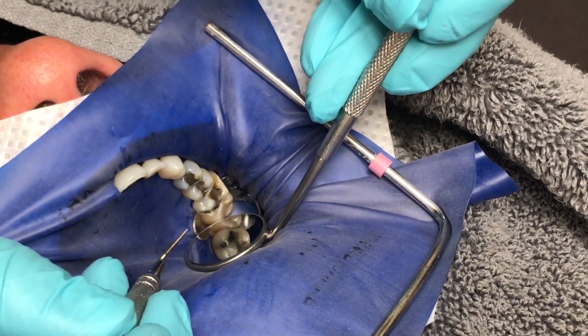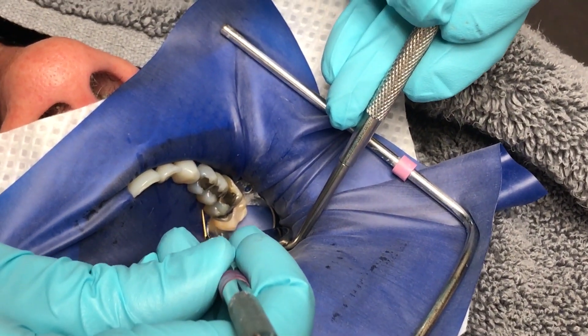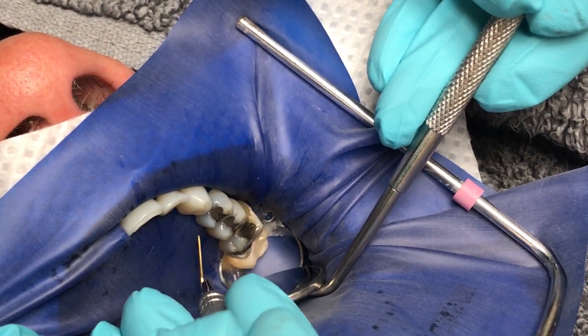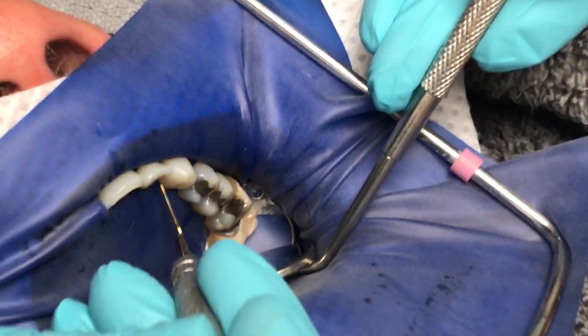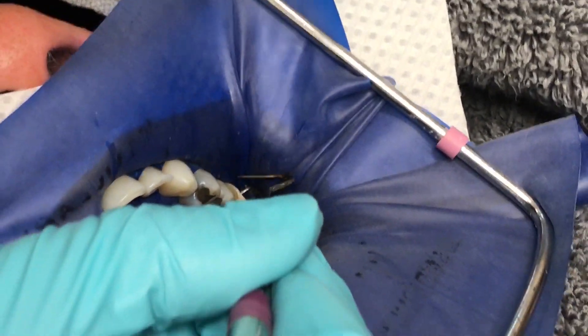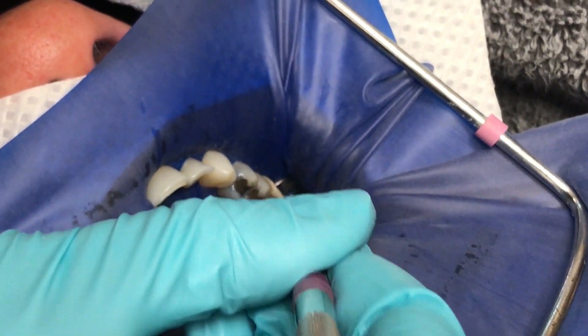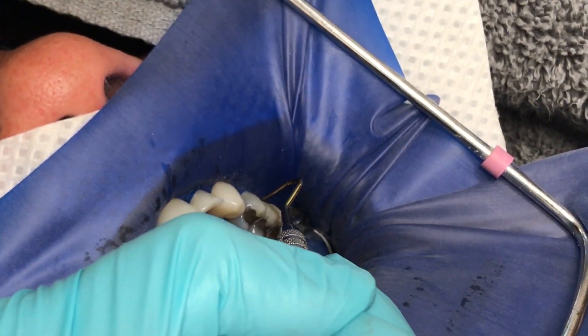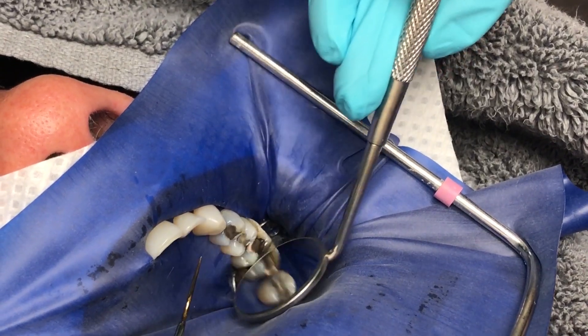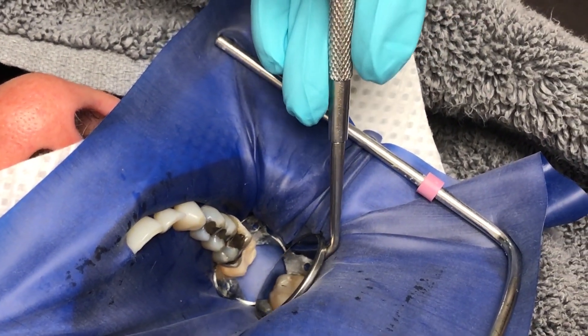Lastly, I use the Clark Explorer to invert my dam on the lingual. While pulling the dam taut, I then invert the buccal side. One last inspection of everything with my mirror is then done to make sure that the dam is finished.